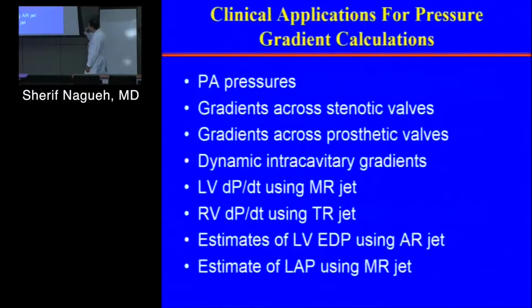These are the applications: looking at PA pressures, gradients across stenotic valves, prosthetic valves, intracavitary gradients, calculating dP/dt for the left ventricle using the MR jet, and dP/dt for the right ventricle using the TR jet. Then you can look at estimates of LV EDP using AR and estimates of LAP using MR.